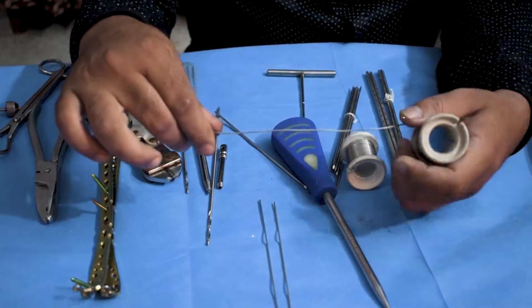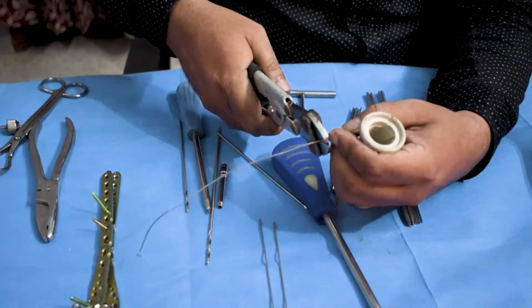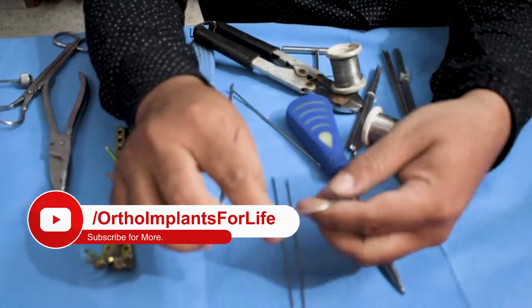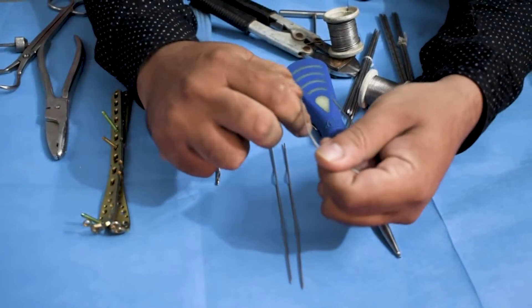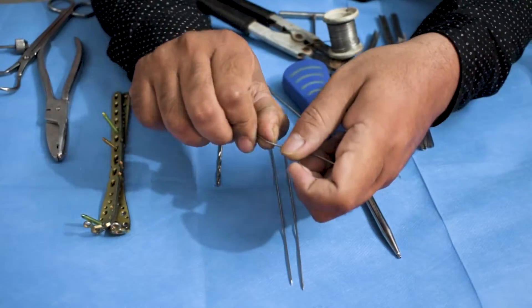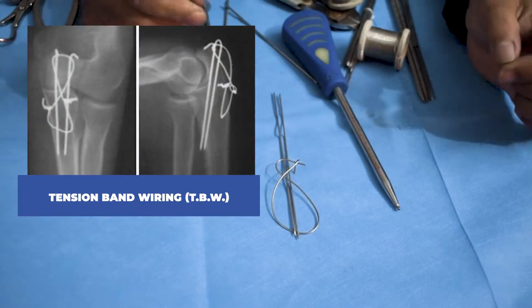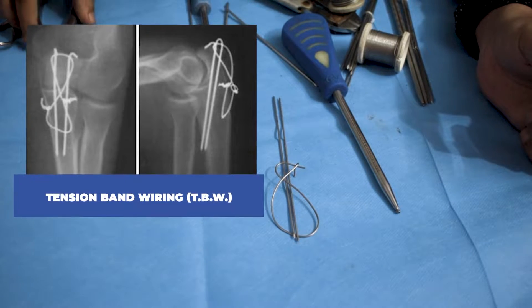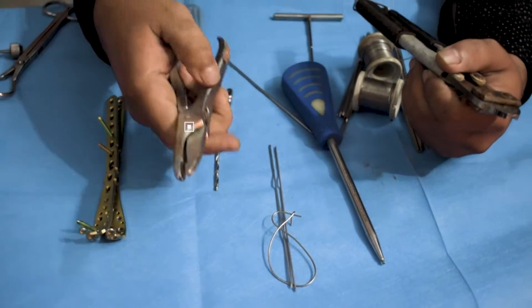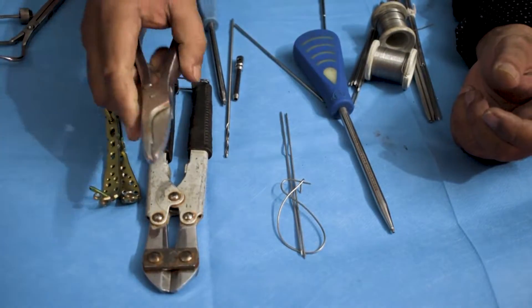Then an SS wire is used, tied in a figure-of-8 configuration. To perform this fixation, you drill a hole in the ulna, after which the K-wire is fixed with the SS wire in the figure-of-8 pattern. This helps greatly in union of the bone and is called TBW — tension band wiring. After this, the K-wire is cut to the desired length. You will need a 3-in-1 plier and a wire cutter to perform this TBW process.